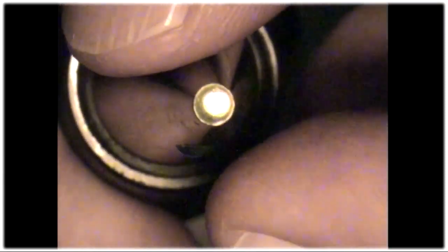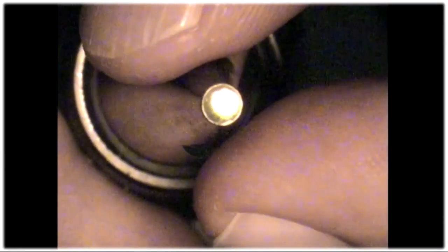In this video, we can see the mild but focused ultrasonic vibrations of the probe tip, which are so gentle and so benign that we can actually stop them by forcefully grasping the tip, which cannot be done with a phaco tip, which has 10 to 12 times higher ultrasonic power.